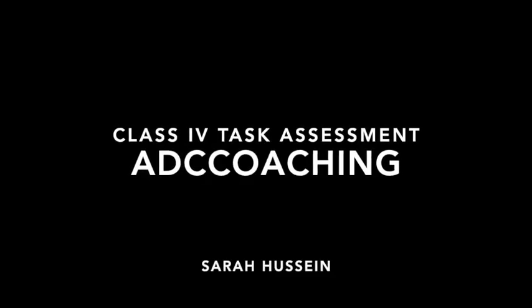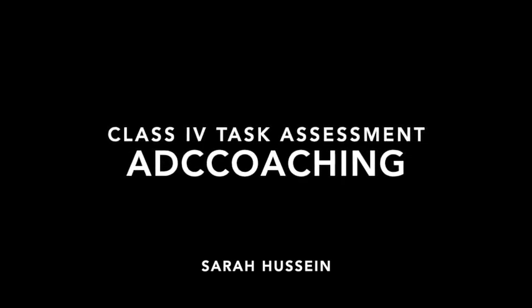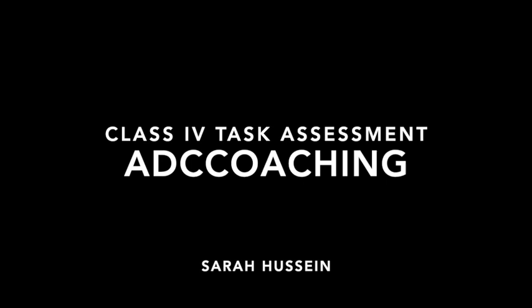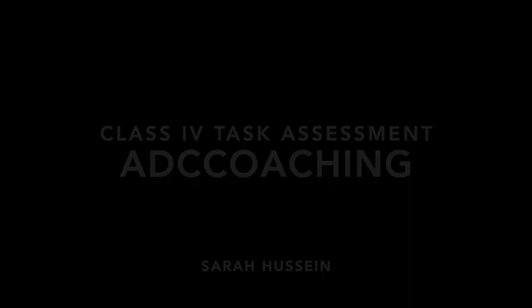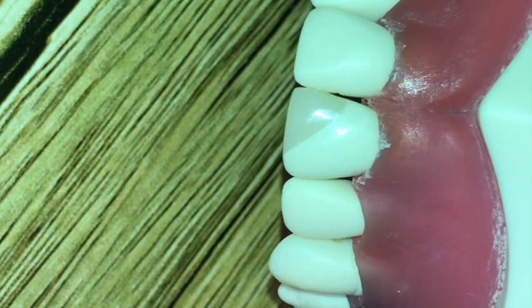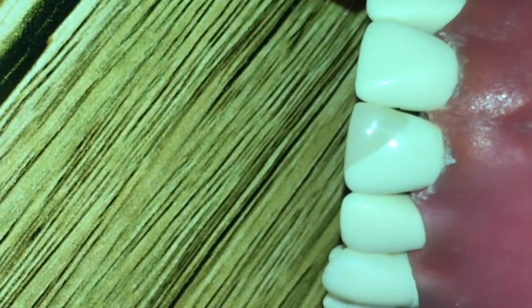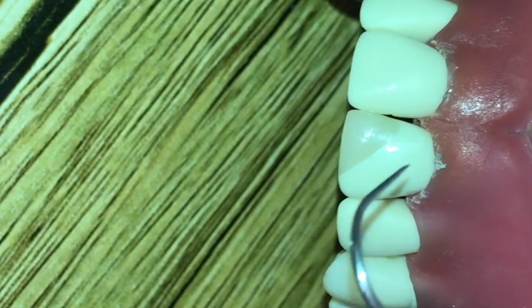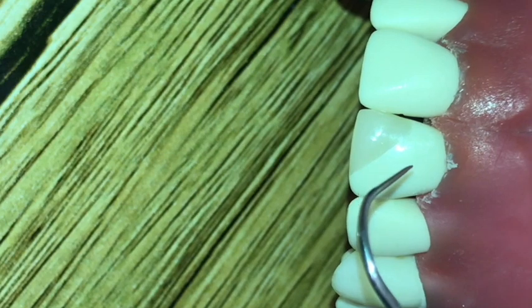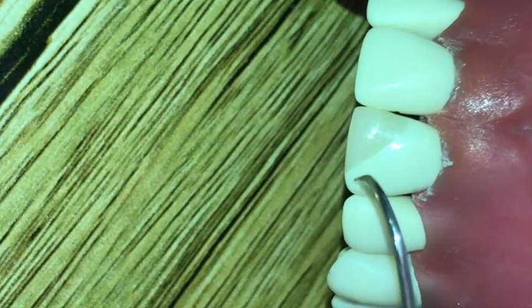Here's how you can do self-task assessment for Class 4 composite restoration. Right after you finish the restoration, first of all, looking at your restoration from a labial view, you should be seeing the full contour as compared to the adjacent.